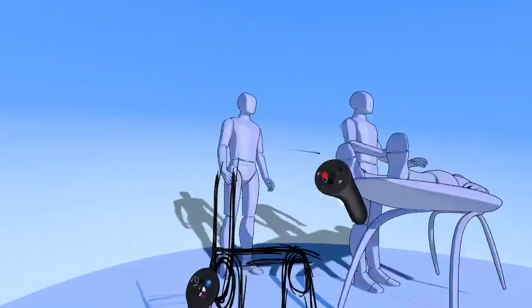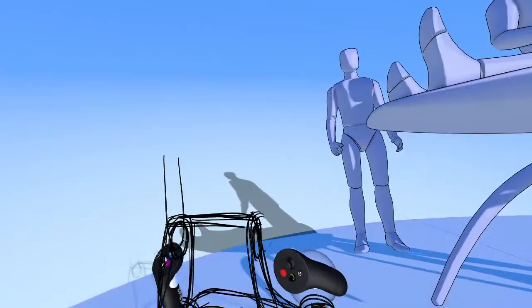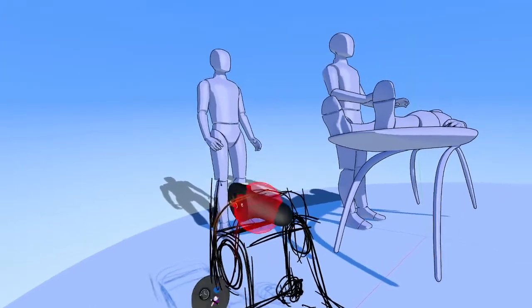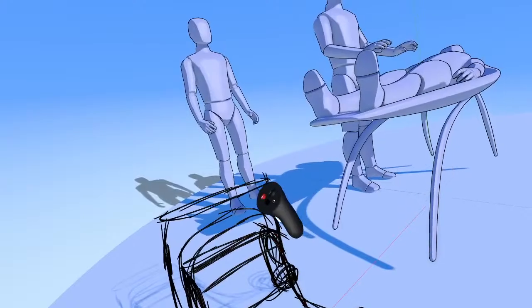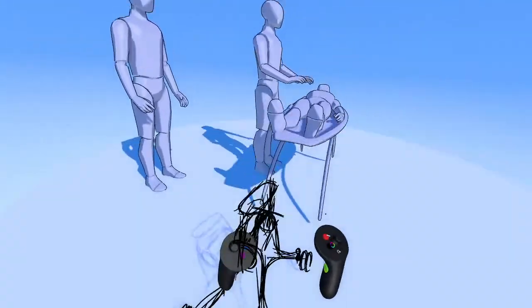All right, and let's swing that up into what I guess we'll call the upper body of this thing. Again, just sketching loosely, just getting the thinking out. And by the way, if you guys have any comments on the design or ideas, please do drop them in the chat. I'll take a look and see if we could work some of them in.